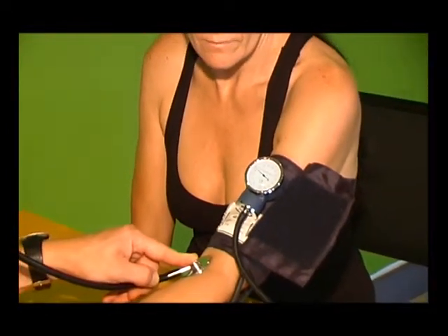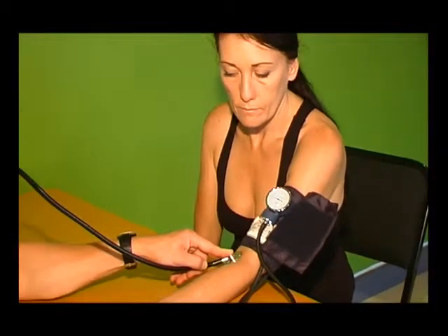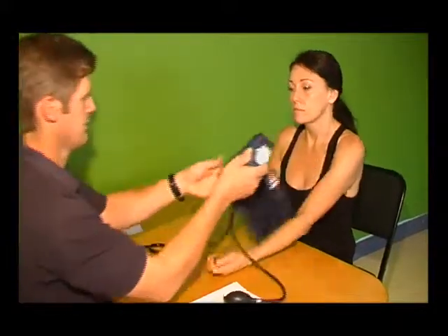Tighten the release valve on the bulb and then pump the bulb until the gauge reads approximately 160 mmHg. Then open the valve and release the air slowly. At the same time, watch the gauge and listen for the first beat sound. This first sound is the systolic pressure — remember it.